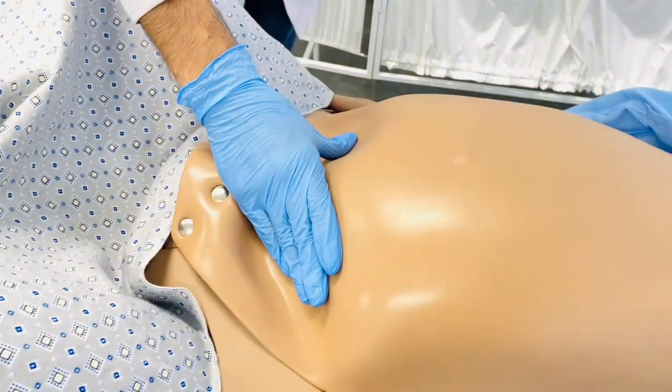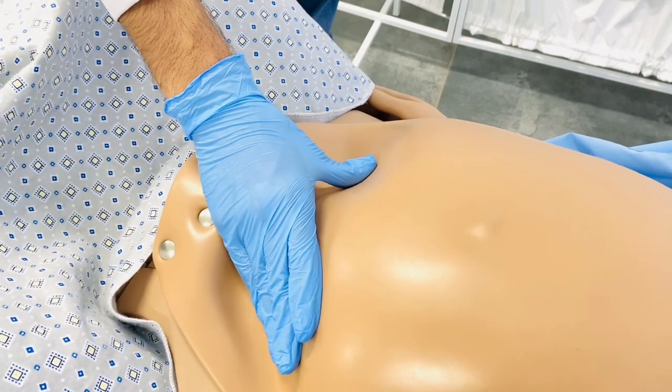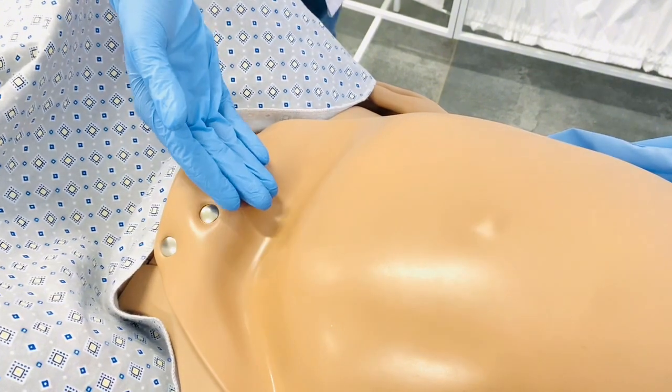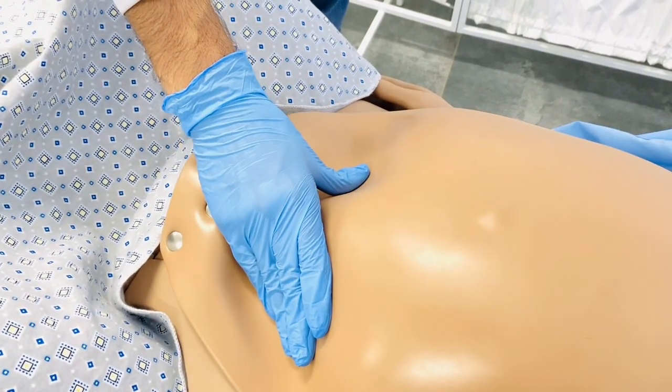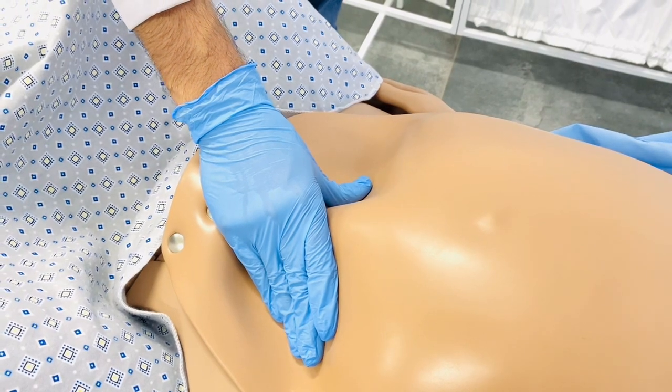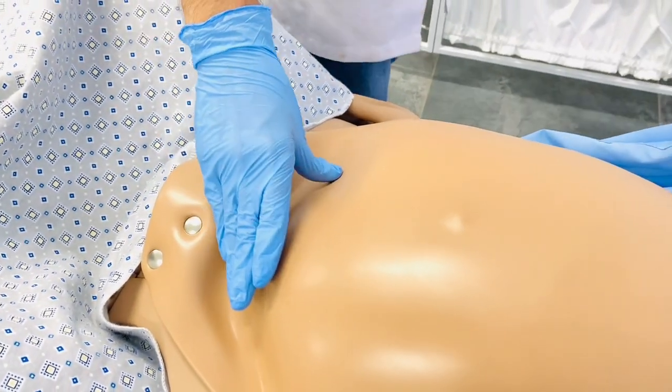The third grip is the pelvic grip. If during the pelvic grip we find any hard structure, this is the head of the fetus. But if we find any softness during the pelvic grip, this is the pelvis of the fetus. After that, from the Leopold maneuver, we have palpated where the location of the fetal back is and where we can auscultate the fetal heart sounds.